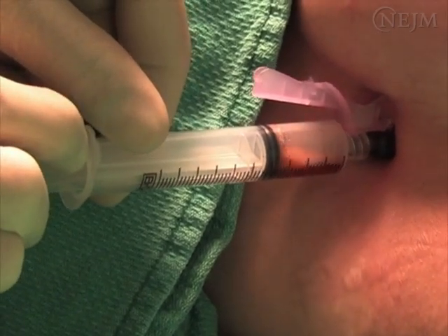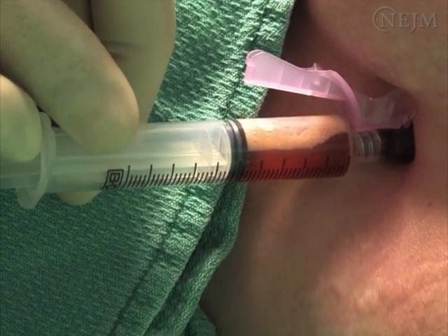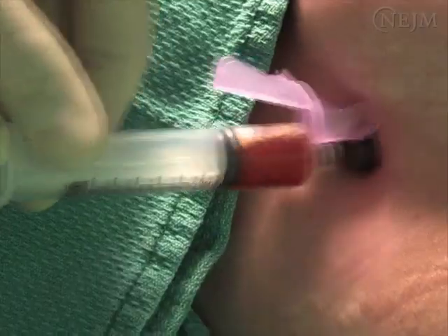Once the parietal pleura is encountered, a flash of pleural fluid will fill the syringe if a pleural collection is being evacuated. If a pneumothorax is being drained, the syringe may only fill with air as the needle enters the pleural space. Withdraw the needle, aspirating along the entire path.